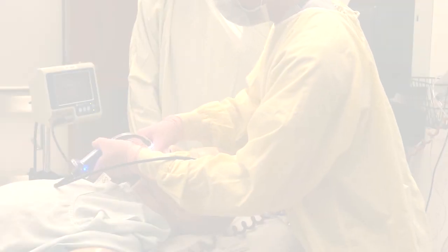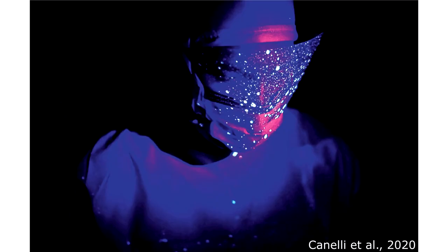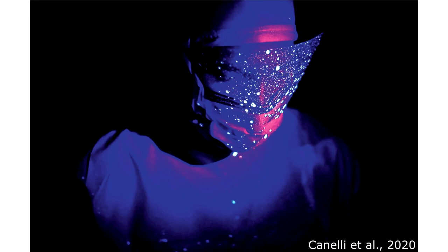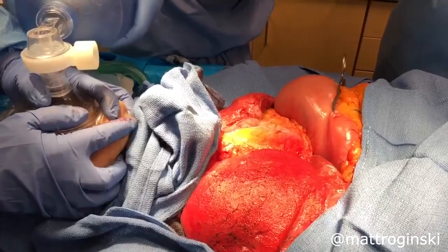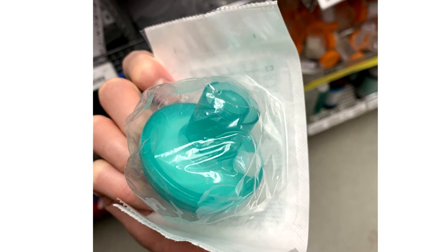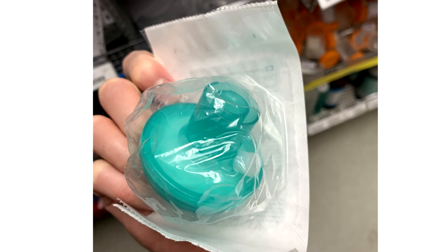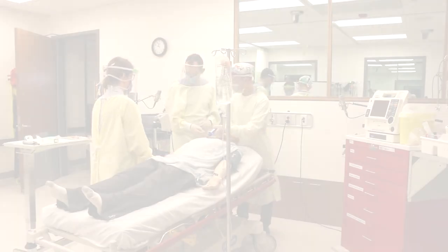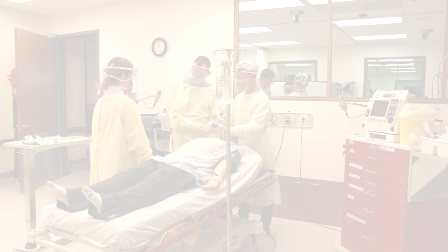While it is important to physiologically optimize these patients, you will have very little time and these patients are very apnea intolerant. The name of the game is doing what you know. Remember to wait after you give paralysis so you don't get coughed on, and don't get overly excited with the desaturation. Remember pulse ox lag — engage with chest rise and or inline capnography. When you've secured the endotracheal tube, remember that you must inflate the endotracheal cuff and put a viral filter on before you bag the patient. Your primary job is to keep your nerves with you when everybody is in PPE, hot and stressed. Good luck.